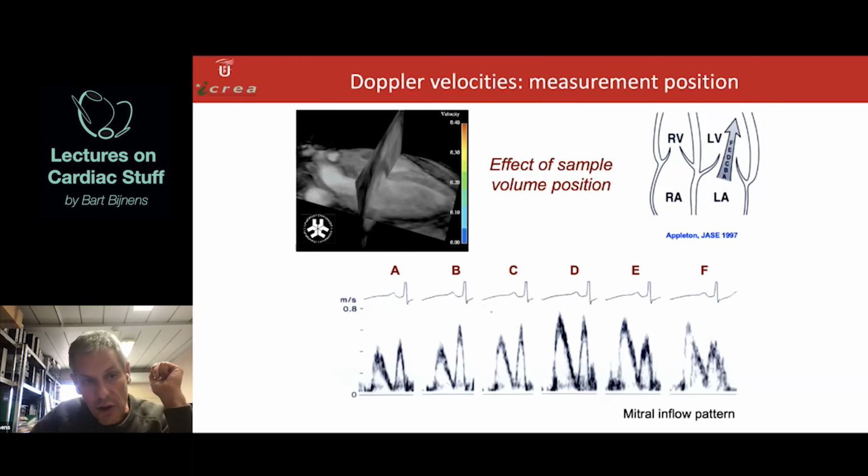And when you look at this physiologically and morphologically, as we said before, you have continuous flow in the ventricle, but of course the flow in the ventricle itself starts to spread a little bit, and you start to get this vortex and reverse flow. So depending on which position in the ventricle you measure, you get different profiles, different measurements. Also, when you would do learning based on these flow patterns, it's really important to always have it at the same point. The clinical consensus is to measure it in between the tips of the mitral leaflets.